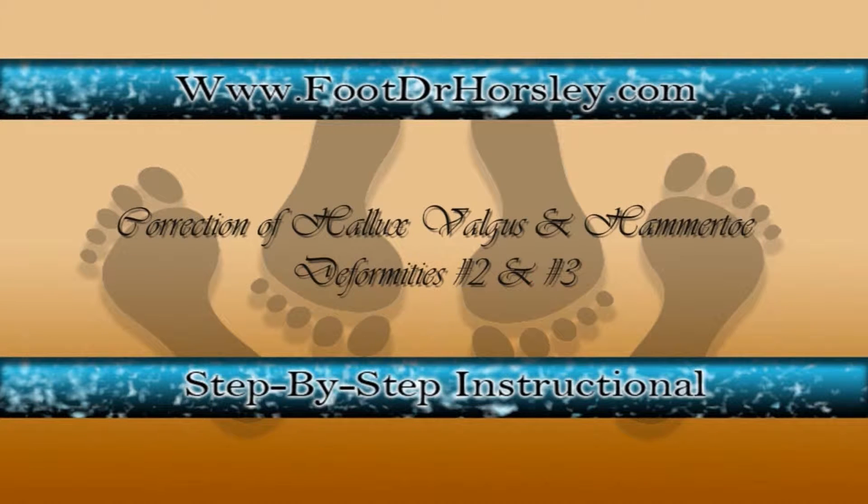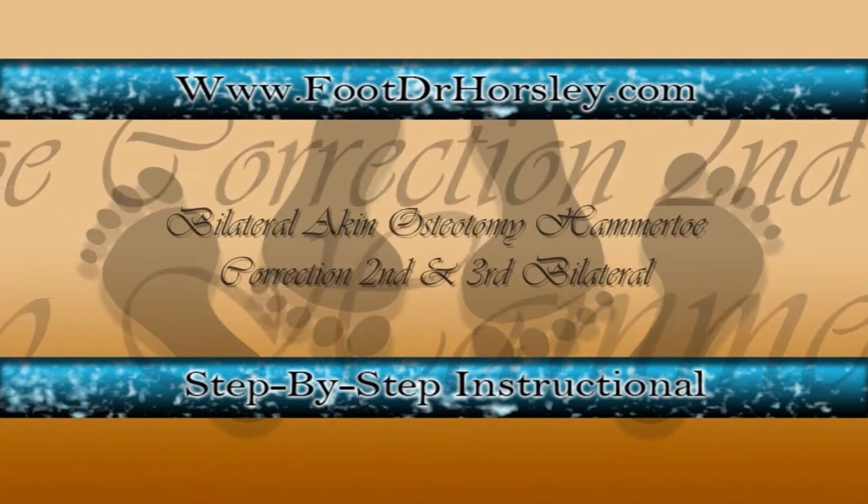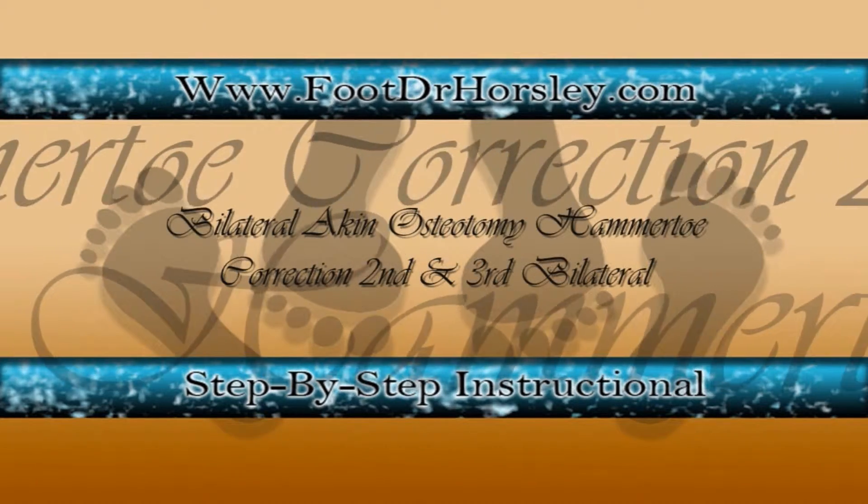The following video demonstrates a correction of hallux interphalangeus with overlapping second digit and hammer toe corrections 2 and 3, by lap.